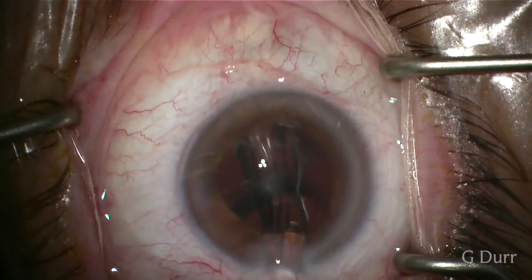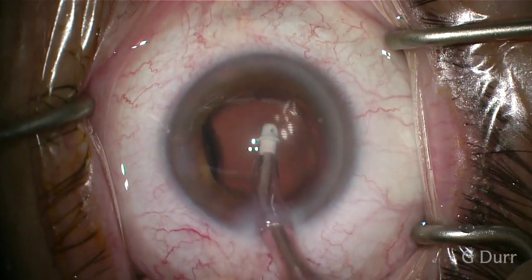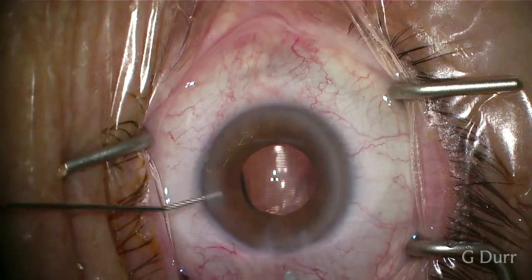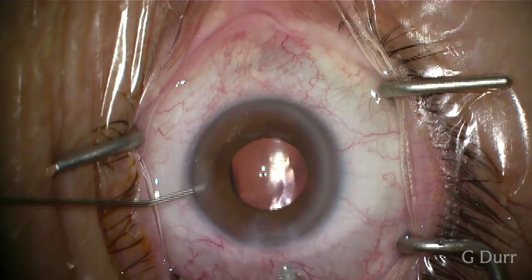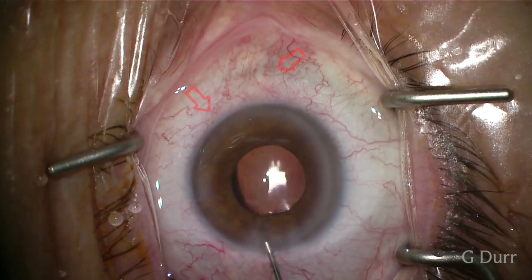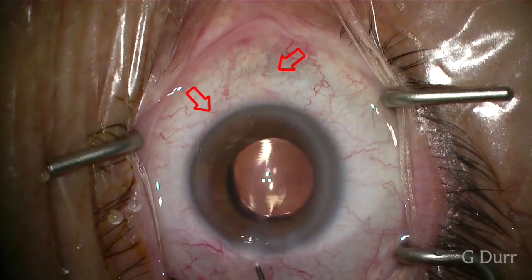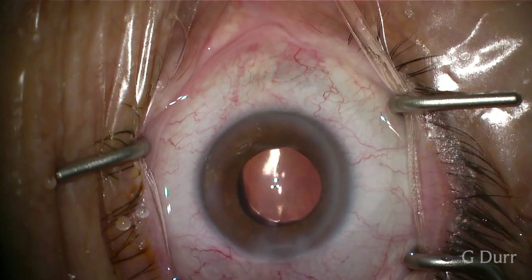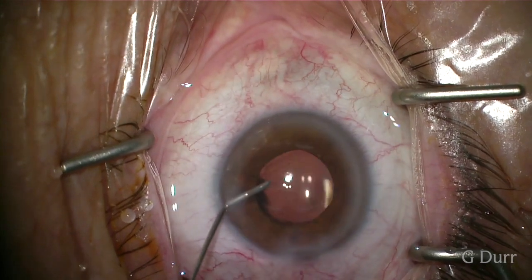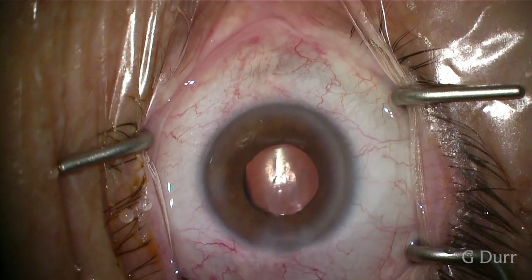We assess flow from the nasal angle in the aqueous veins, which is one of the potential prognostic signs. When we're coming in and out of the eye we're trying to maintain the anterior chamber with either balanced salt solution or some viscoelastic. Here when we're hydrating our incisions, we're seeing these aqueous veins blanch in the nasal angle at two different spots — something we feel is a potential positive for our patients. This patient did quite well with pressures in the mid-teens and minimal heme postoperatively.